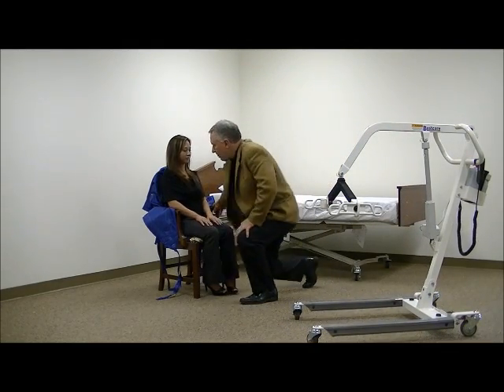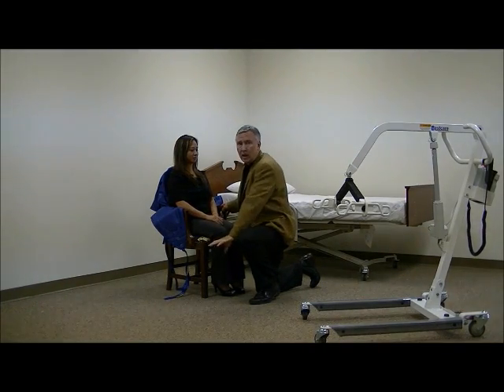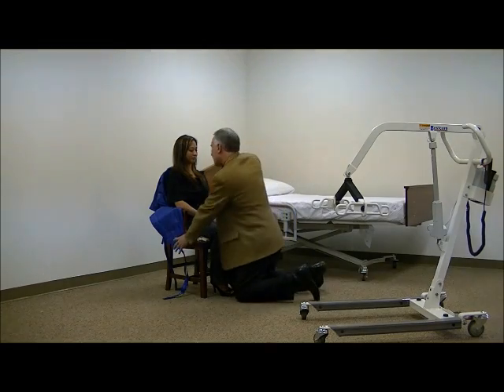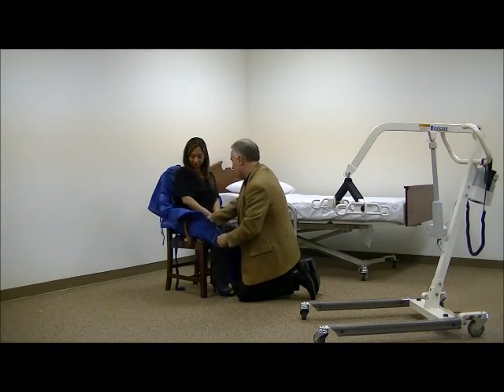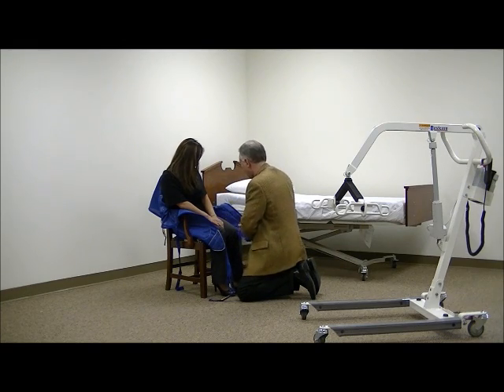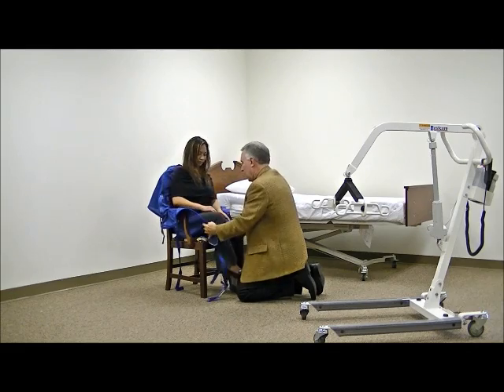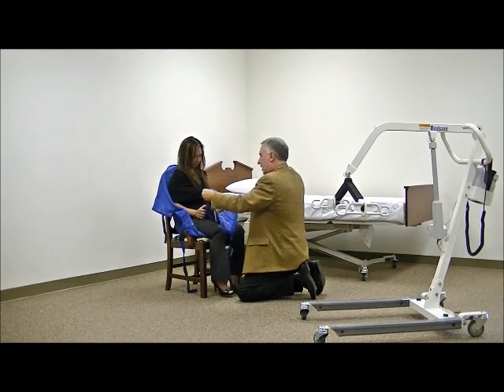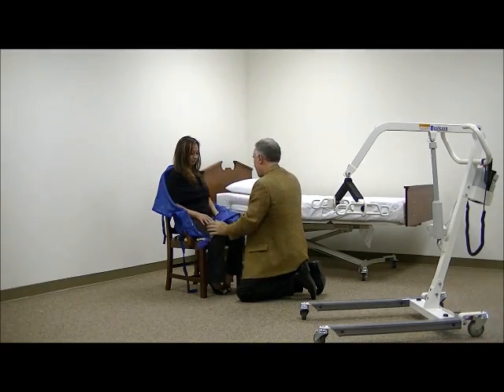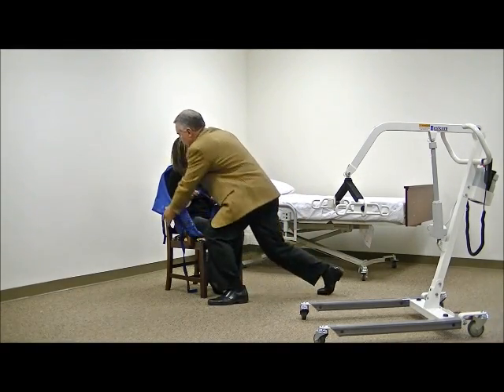The next step is always use good body mechanics when you're applying the sling, by the way. Get down to the right level so you're not tugging and pulling at a high level, hurting your back. We're going to take the edges of the sling and bring them around the hips and then underneath the legs and give them a little tug. Last step is to crisscross the sling. Now we're going to connect the sling to the hanger bar, to the spreader bar, to make the transfer.